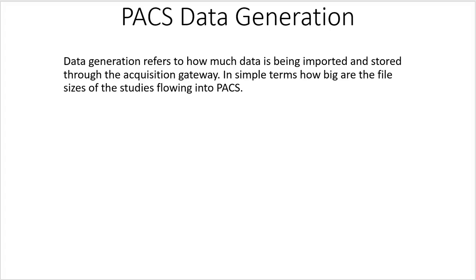Today let's talk about PACS data generation. Data generation refers to how much data is being imported and stored through the acquisition gateway or DICOM server. In simple terms, how big are the file sizes of the studies flowing into PACS?